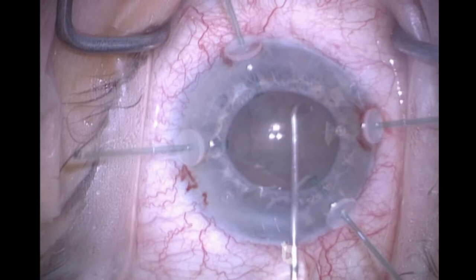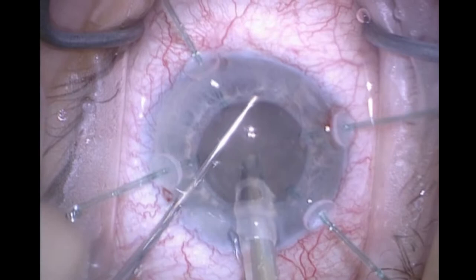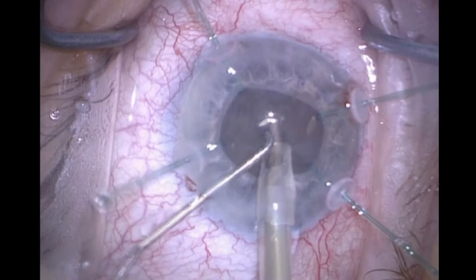Now they are anchoring the capsular bag, and we have enough counterfixation so it allows me to rotate the nucleus. It's a relatively medium nucleus, so horizontal chop is working fine here.